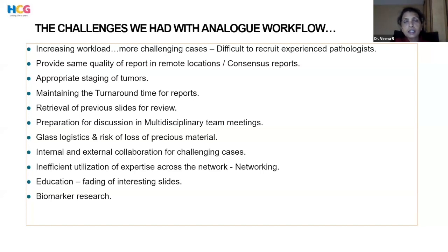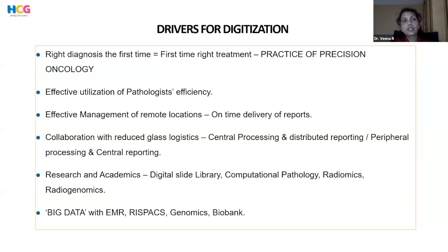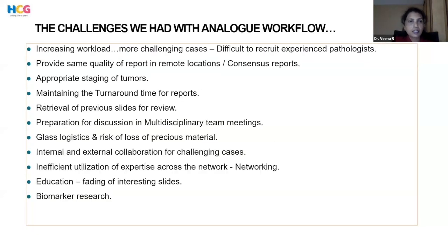And then maintaining the turnaround time of the reports with an increasing number of cases was again a challenge. Whenever we had to go back to previous slides for review, we had to dig these slides out from the archives, and that used to take a lot of time. And every day we have multidisciplinary team meetings, so preparing for these MDTs again used to take a lot of time for us.